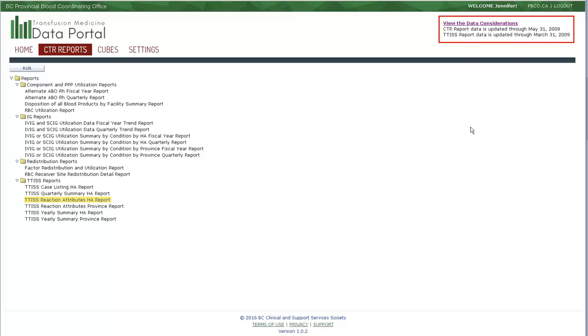So different report types will ask for different types of parameters. As we saw, some are drop-down lists and others offer a little more flexibility. As before, the best way to learn more about the reports and how to run them and look at the parameter options will help you decide how best to view the data that they offer.